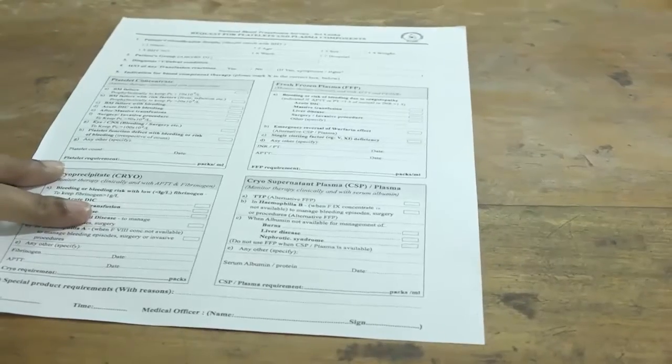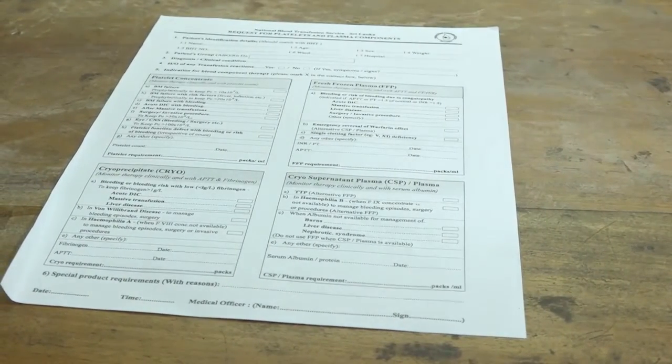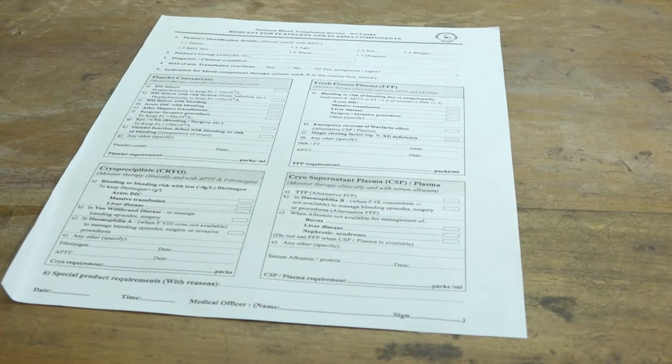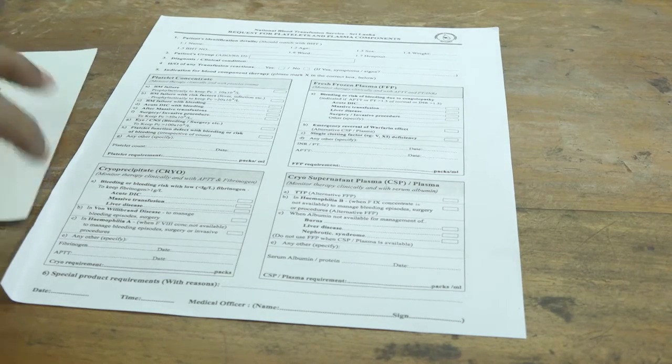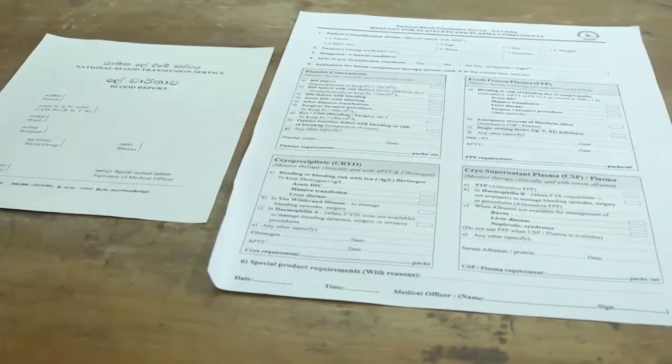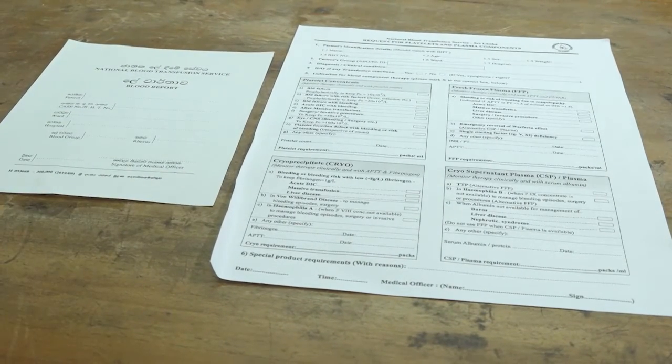When you are requesting platelets or plasma components, you have to fill in this form and send it to the blood bank. Because there is no compatibility testing done for platelets or plasma, but only group compatibility, you must make sure that the patient's blood group has been done prior to this and that the blood group report is available in the BHT.